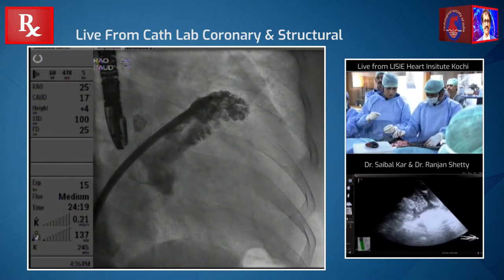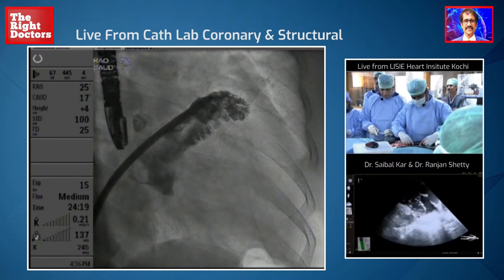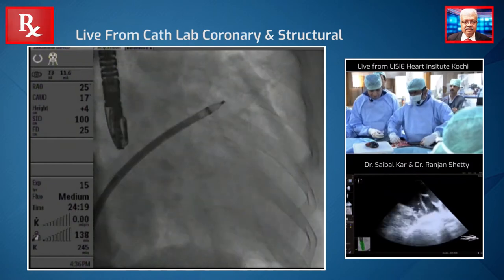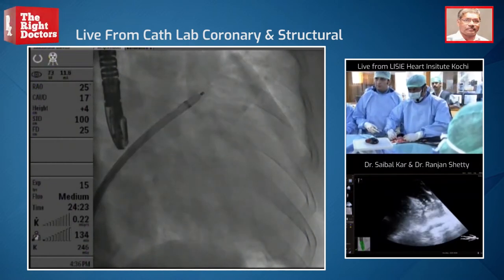So what I'm going to do is I'm just going to create a ball over here, and I'm going to release a part of the device.